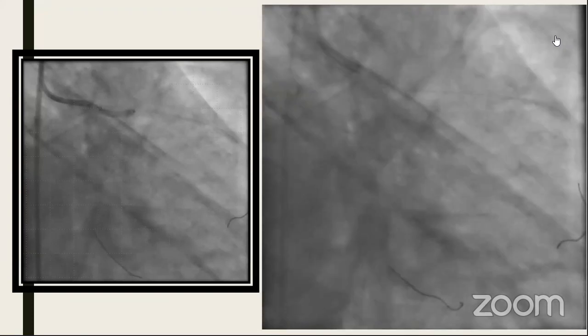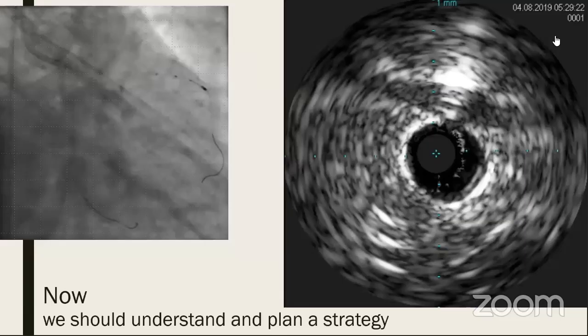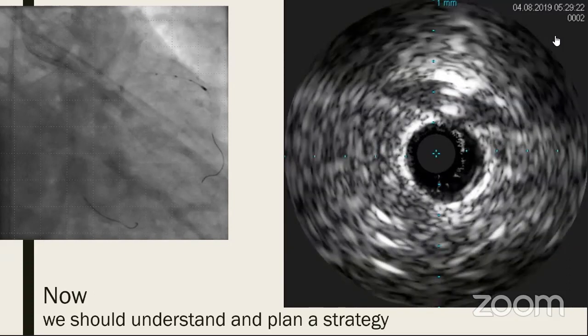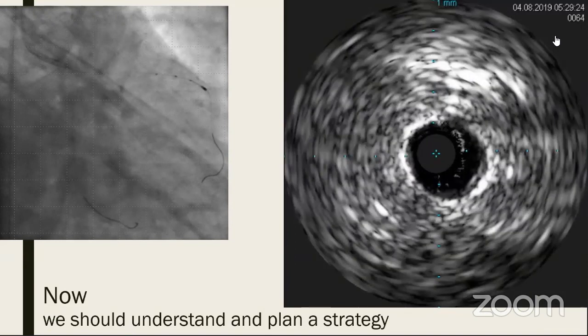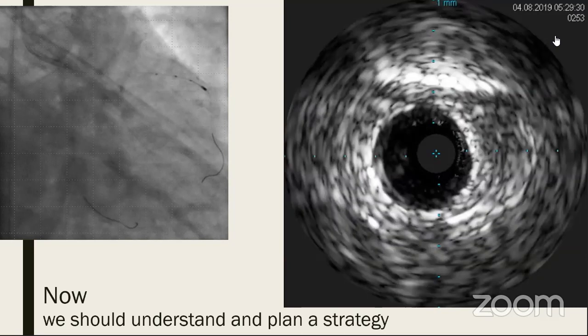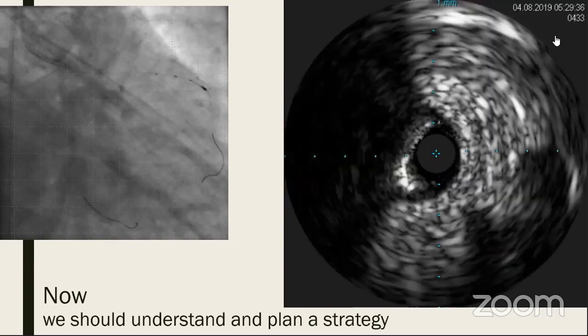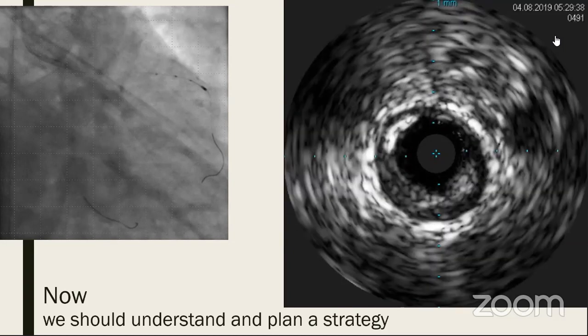After the pre-dilatation, the LAD flow improved a bit, but not significantly. But at least now we can rush and perform intracoronary imaging to understand more where the aneurysm arises from and how this anatomy looks in 3D appearance. This is a pullback coming from the mid LAD, from the healthy part of the LAD, going backwards, quantifying the branches and evaluating where the side branches are. This is the calcific tight stenosis at mid LAD.